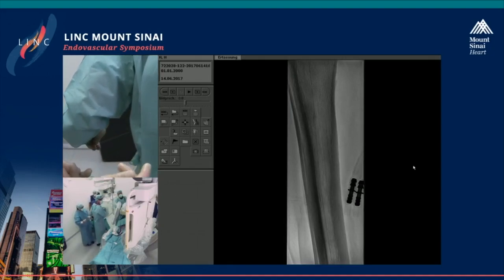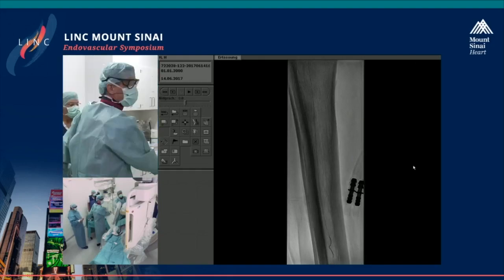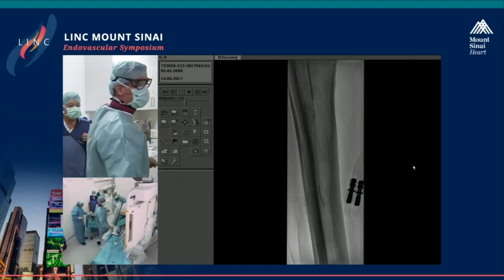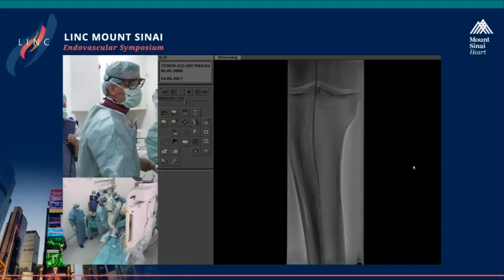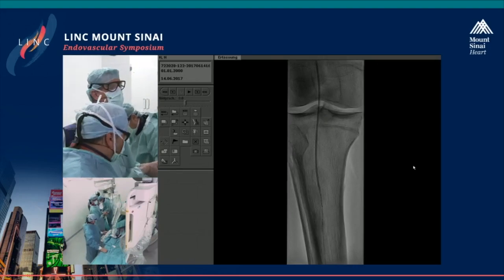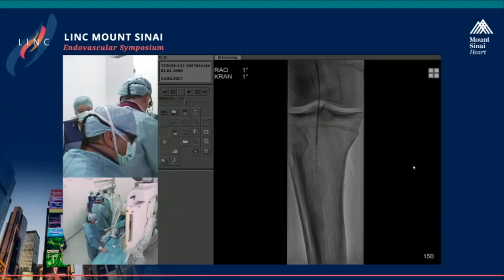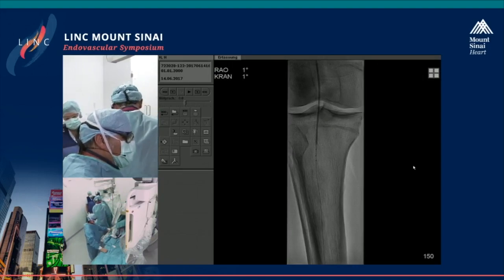Andre, yeah. This is Steven. Yes, hi. That you actually can personalize care. You know, we talk about different agents, paclitaxel, sirolimus, anti-proliferatives, stem cells, anti-inflammatories. This device, you could deliver almost any drug, depending on what type of patient you have. So it really opens up a whole new area of medicine.